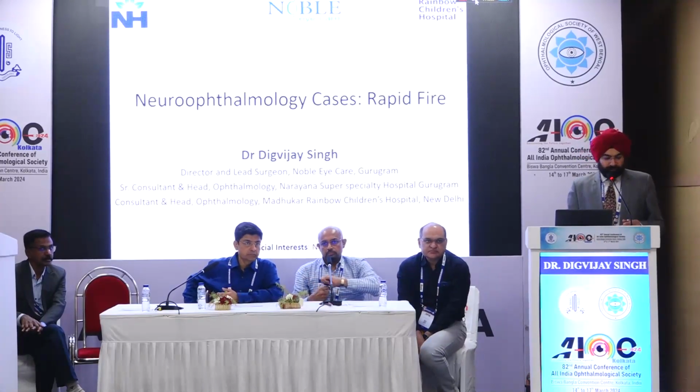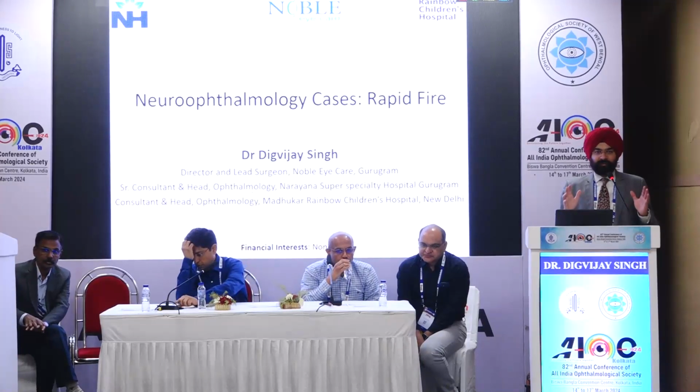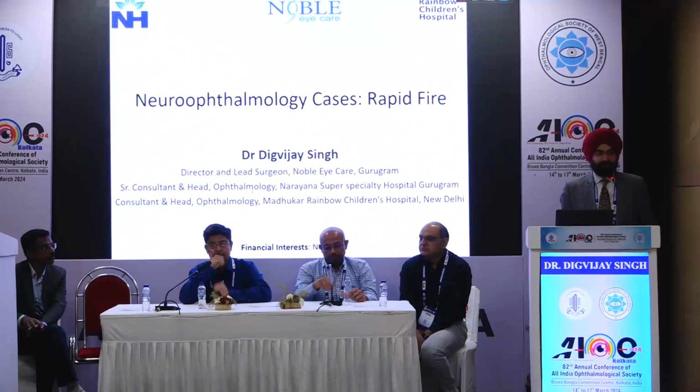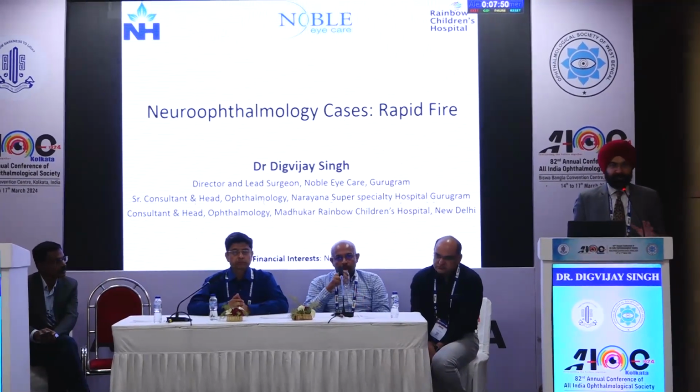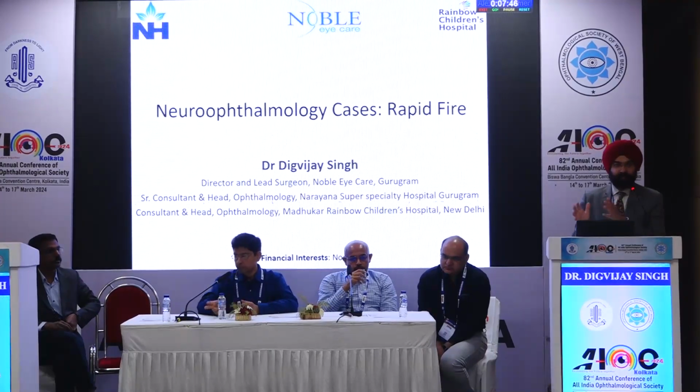So a quick line on neuroradiology. When we look at neuro-ophthalmology, in terms of the radiology aspect of it, we have the X-rays, which are going to help us catch any gross fractures in the skull. But essentially, you've got the CT scan and you've got the MRI.